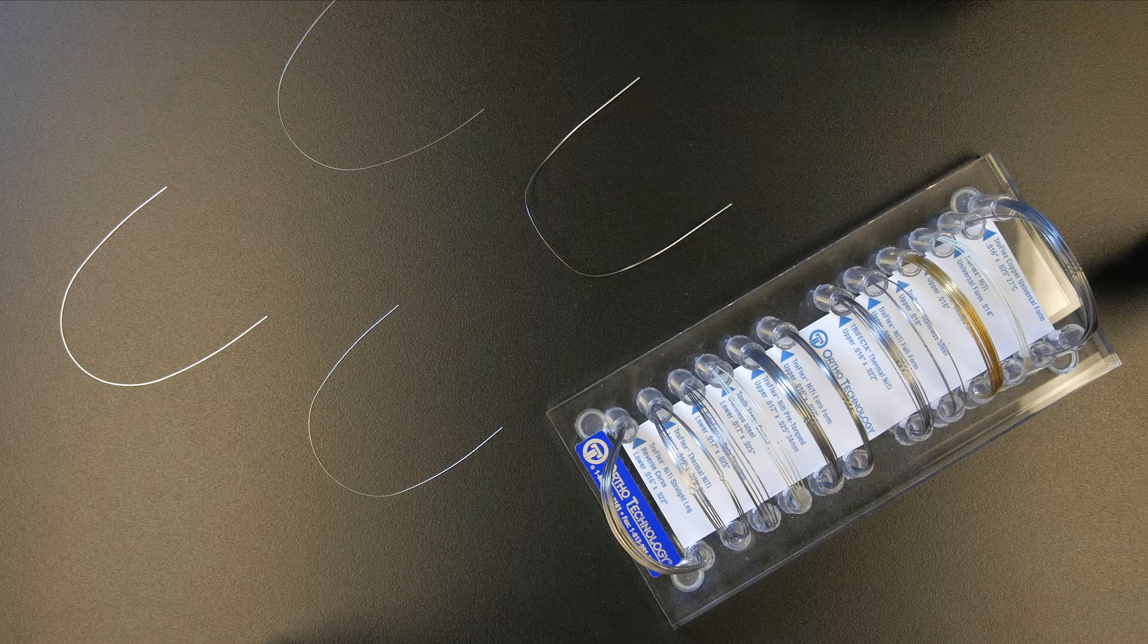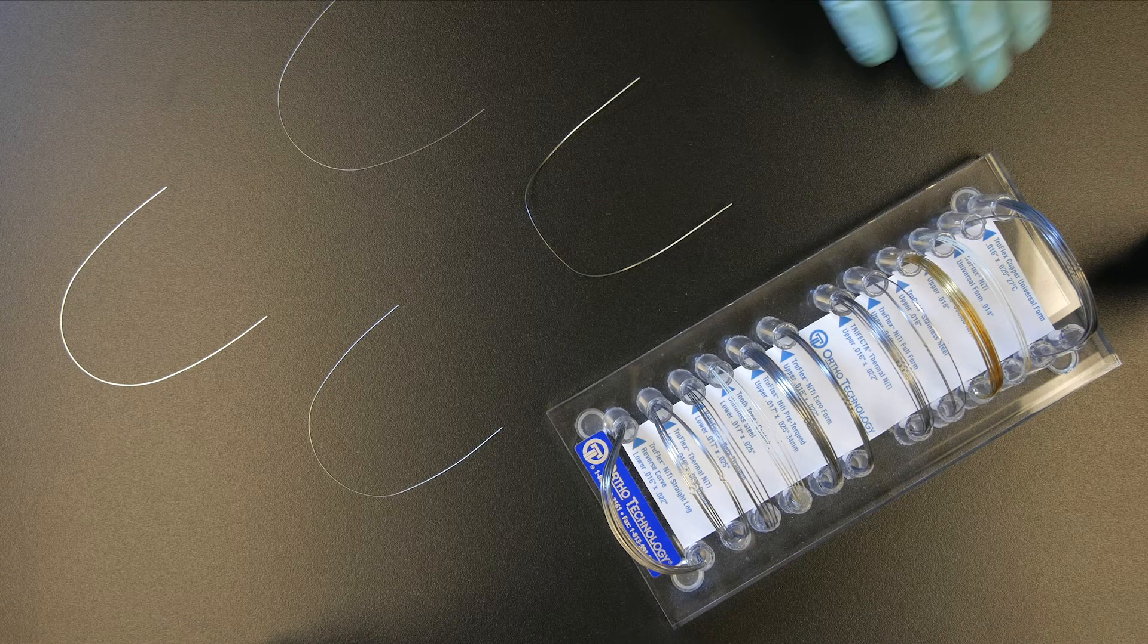This wire is outstanding quality at very competitive prices. You can contact your rep for more information.